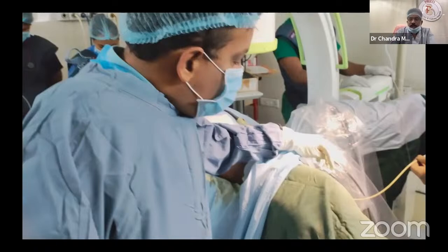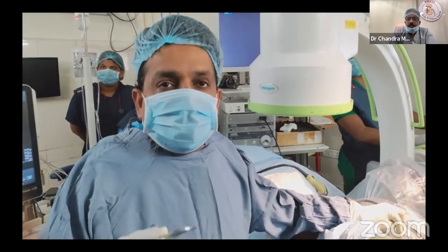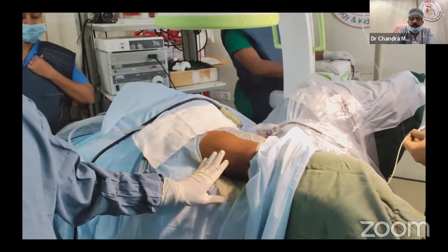Now coming to the position, in the same position we will do the ureteric catheter as well as the RGP and puncture. That we will share here. Tried ureteroscopy, it is very tight. So the option was only stenting. So the patient was in the same supine position.